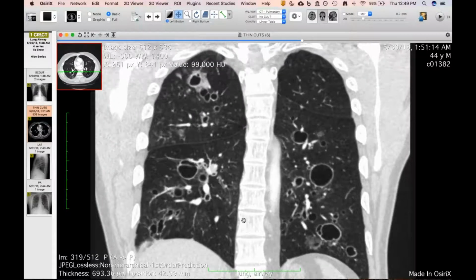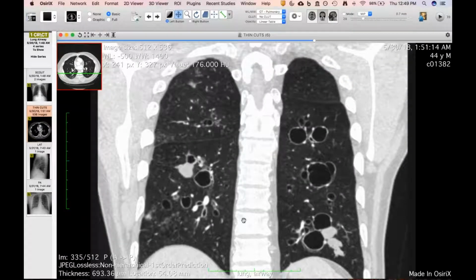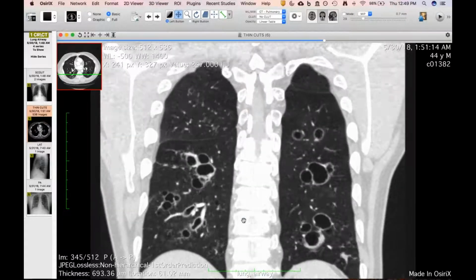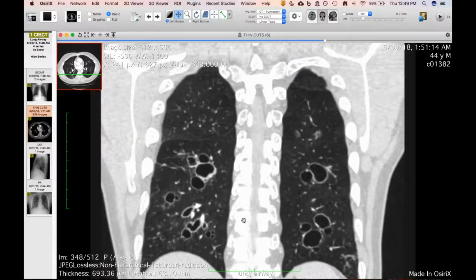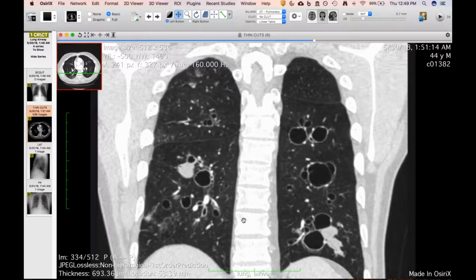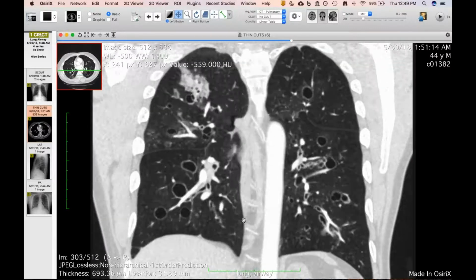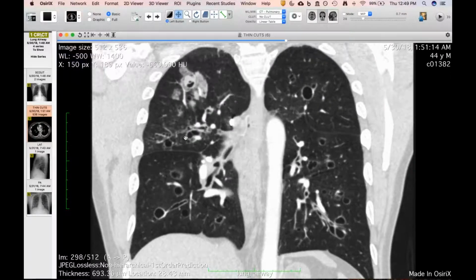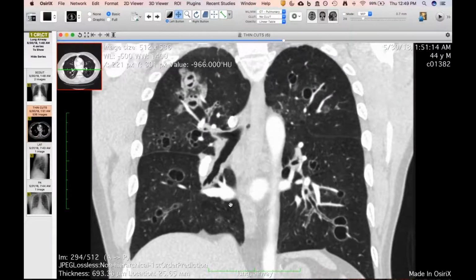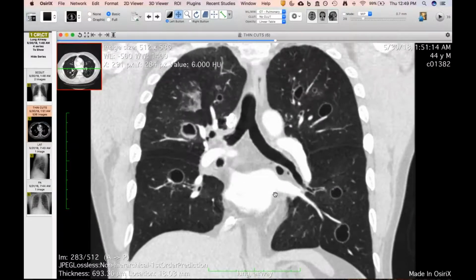So I would go, even though there's a lot of bronchiectasis, because of the small airways as well, I think it'd be important to exclude something like a weird case of chronic atypical mycobacterial infection, even though this would be a bit unusual because there's so much abnormality in those smaller airways. I think they should exclude a chronic infection. Yeah, well, and they'll do an immunodeficiency workup and stuff. I mean, it's pretty diffuse in terms of its craniocaudal distribution.